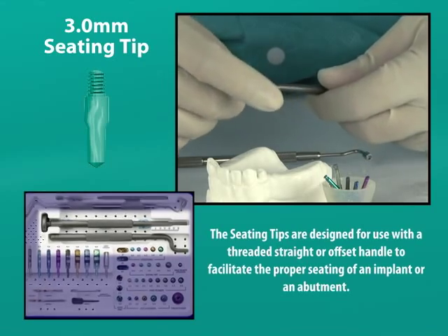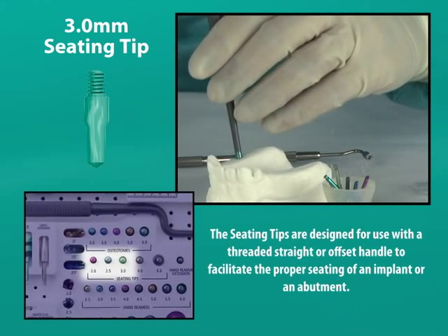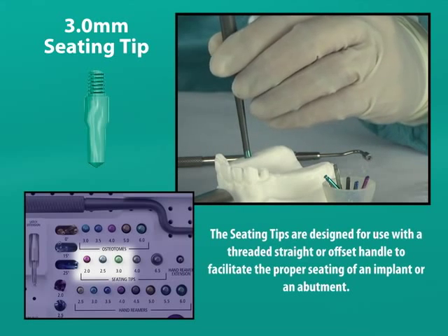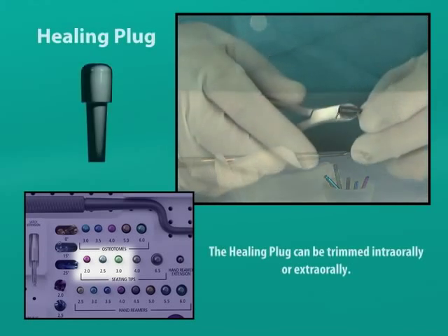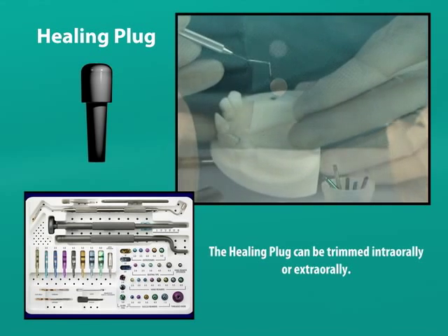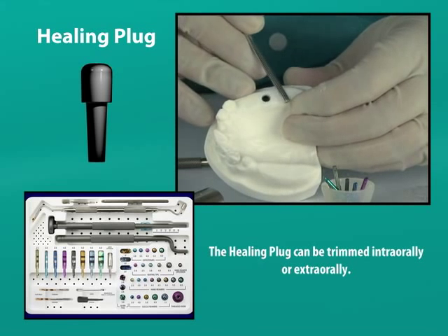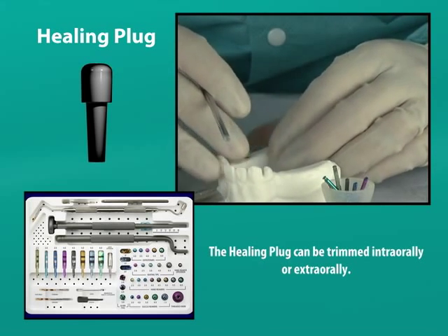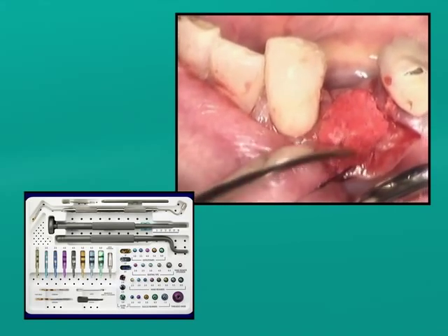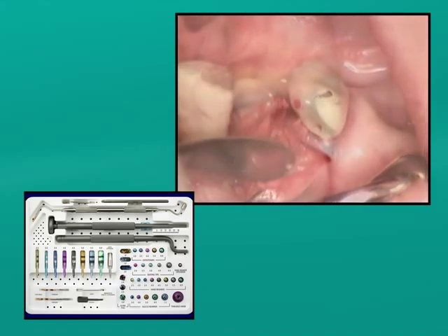To ensure the complete seating of the implant to the intended depth of 2 mm below the bony crest, we will lightly tap it. For that, we use a seating tip that fits loosely into the implant well after having fastened it to a threaded straight handle. A healing plug cutter is used to cleanly cut the post of the black healing plug that was packaged with the implant prior to its being inserted with a perioprobe to seal the well of the implant and to keep it free of bone throughout the period of osteointegration. We will now place the harvested bone from the dappin dish onto a periosteal elevator to cover the implant's shoulder prior to closing the surgical site.